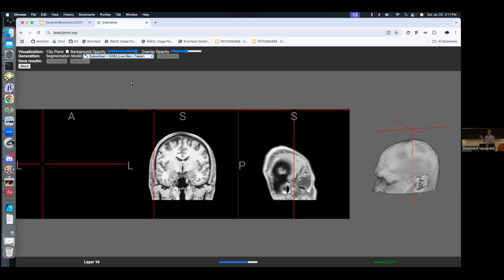The nice thing with using the end user's graphics card to do all the hard work is if you get 1,000 users, you've got 1,000 graphics cards that can do the job, right? So it scales beautifully as you come up with new users.